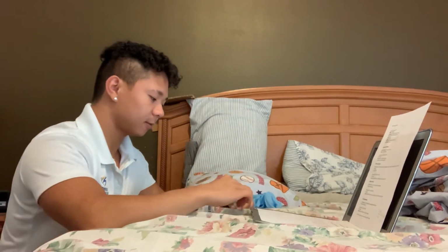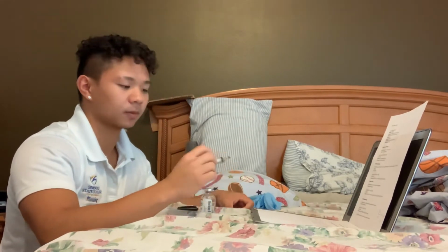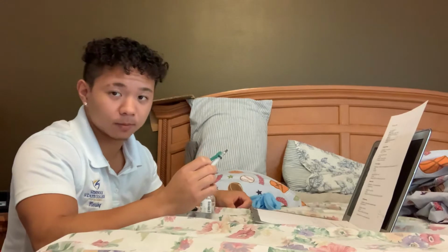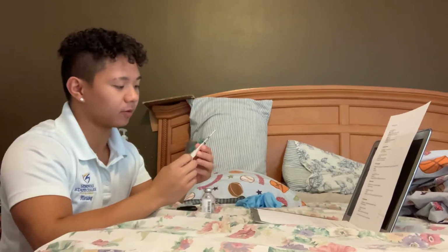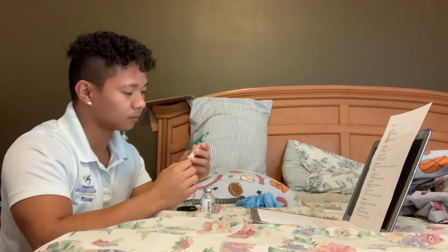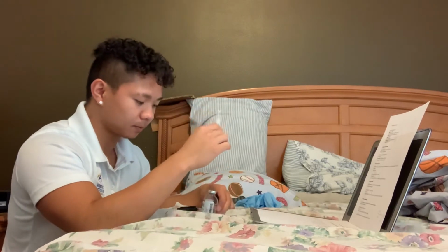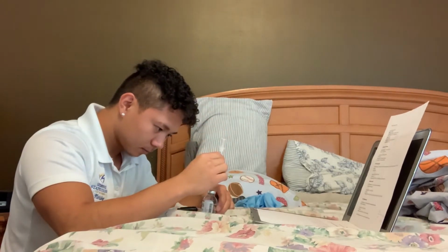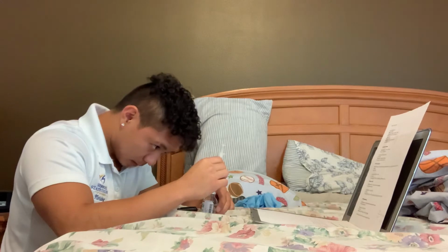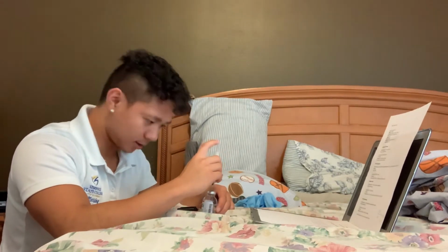After I've done that, I'm going to withdraw 0.5 milliliters of air, and I will place it in the middle of the rubber stopper, and I will ensure it's not touching the solution, and I will inject air into air.